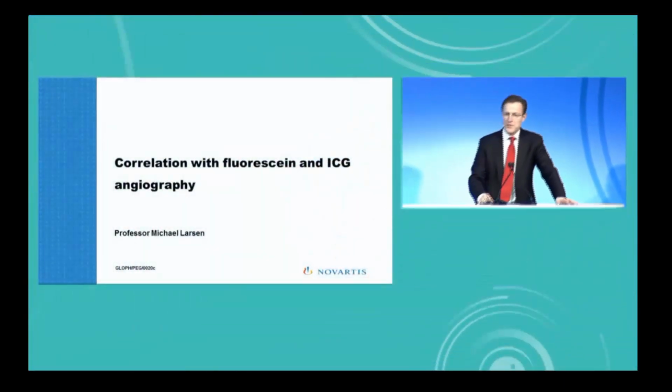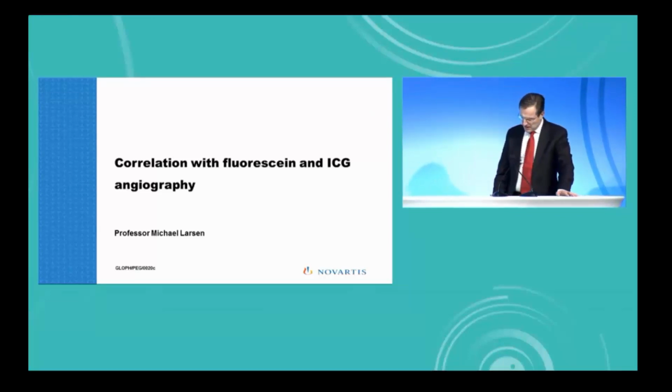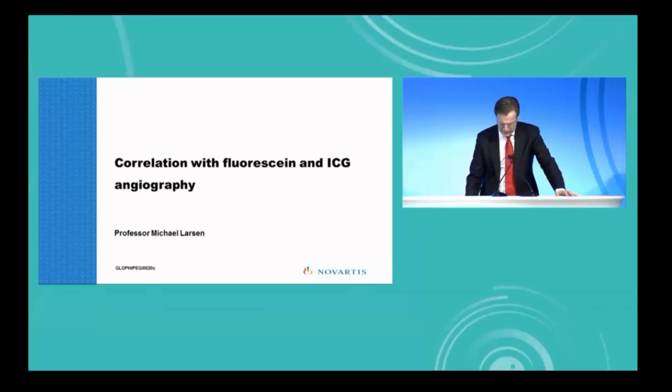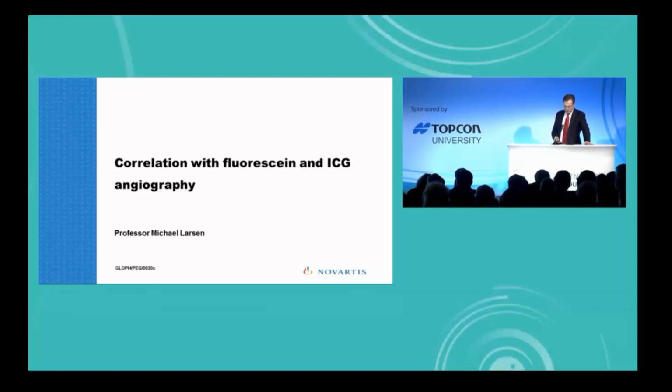I've been given the honor of being the dwarf among the giants, and I will give you an appetizer of what the real guys can tell you by briefly introducing some of the key aspects of OCT angiography and how it may look together with fluorescein and ICG angiography.